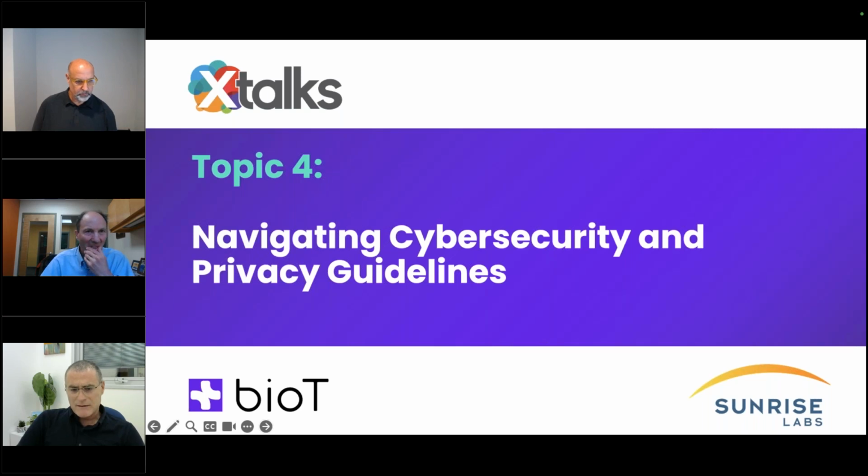Once you understand that, then again, we believe that the cloud becomes a major tool here to actually comply with the regulations and enable you to handle cyber devices in the proper way. So basically, what does it mean? We're talking about vulnerability monitoring and updates, monitoring the situation and updating it.